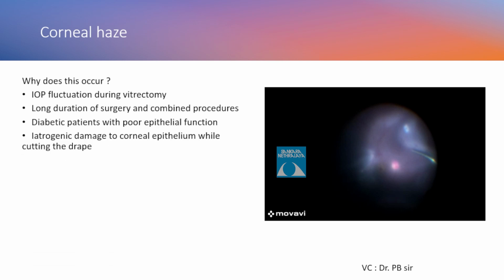Okay. Here I would like to say that with experience, you find that the number of cases where you remove the corneal epithelium becomes lesser and lesser. I still remember that maybe in the 1990s, when I started my vitrectomy surgery, I was ending up removing the epithelium in almost every case of retinal detachments and diabetic patients. The worst thing that happens is post-operatively, the epithelium doesn't heal easily in diabetics. Then you end up, those days we were not using bandage contact lens. You kept on bandaging the eye for 2 days, 3 days, and trying to get the epithelium to heal.